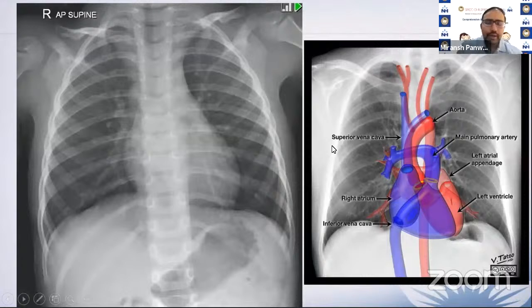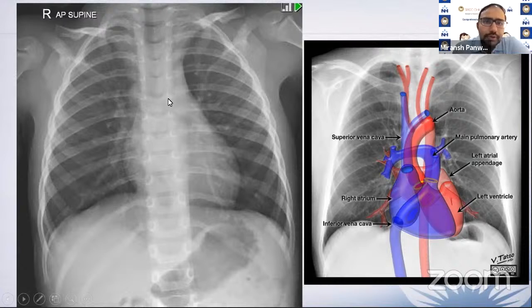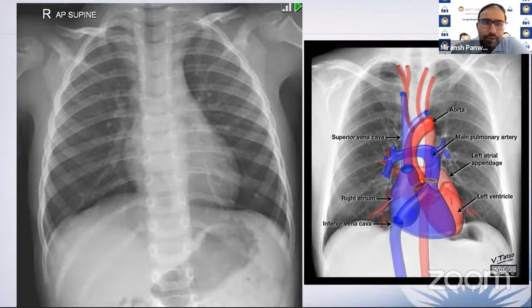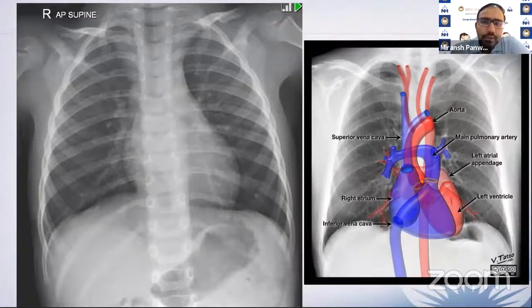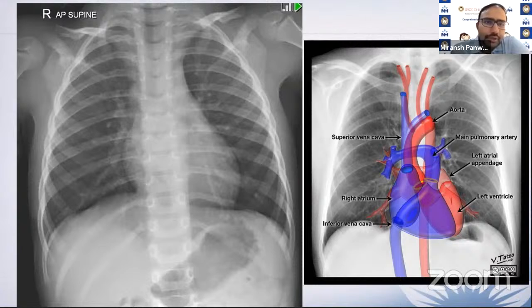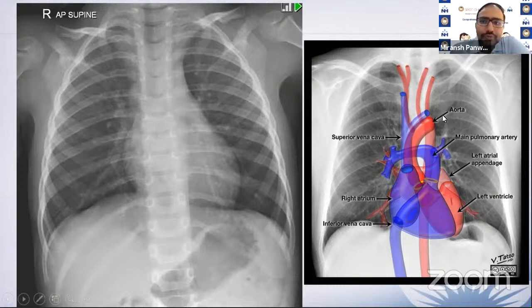Here is a view of a normal X-ray and how it should be taken. Pediatric X-ray differs from adult X-ray: children under two years have large thymus, which is a common masquerader for a mediastinal mass. Children under three or four years who cannot cooperate for a PA erect film are imaged with AP supine films, so there are certain important differences between AP supine and PA erect views.